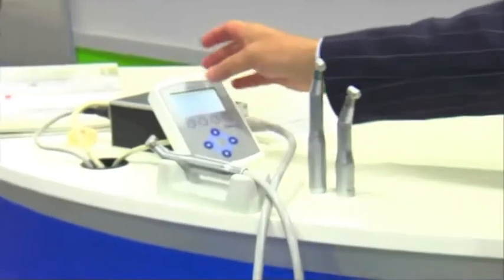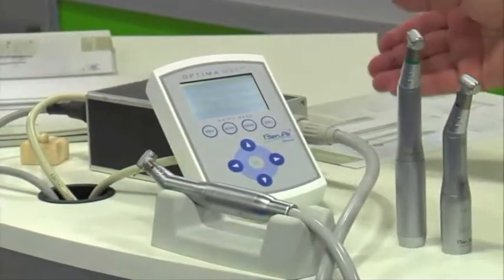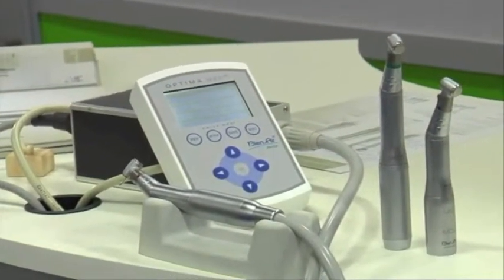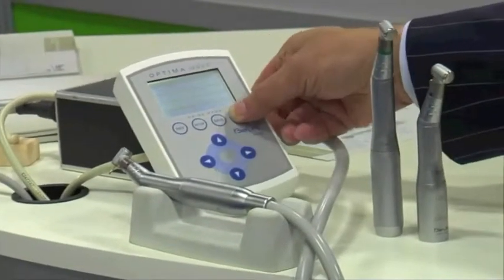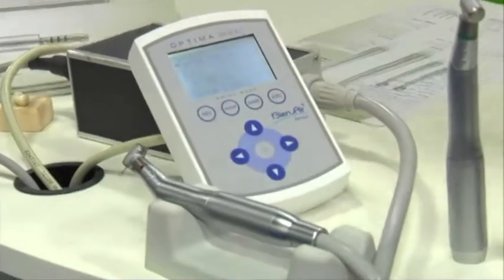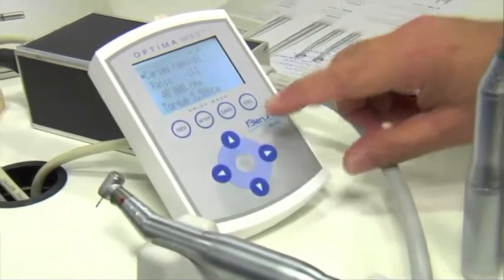This module, which is our touch pad, not only allows the user to use it for high and slow speed but also provides capabilities for doing implant and endo. Most of the endo sequences from major companies are pre-programmed. All they have to do is go from our operative mode to the endo mode and go through each of the individual files that are pre-programmed. There are 20 additional settings provided for endo as well as for operative, and users can reduce those settings down to two if they would like.